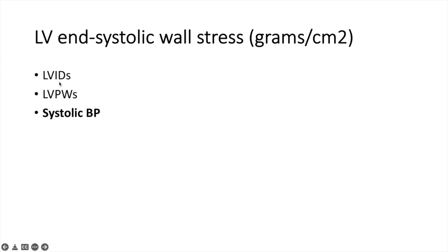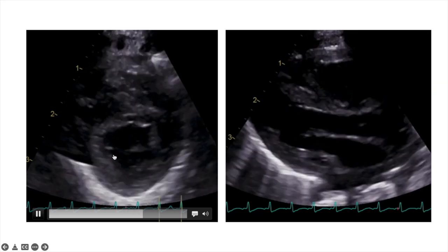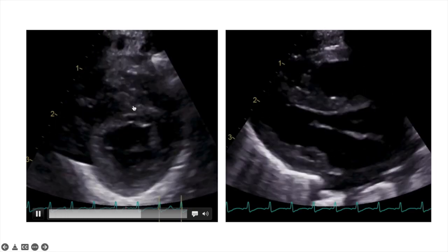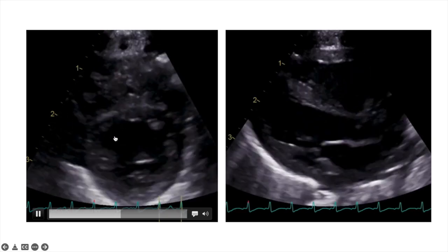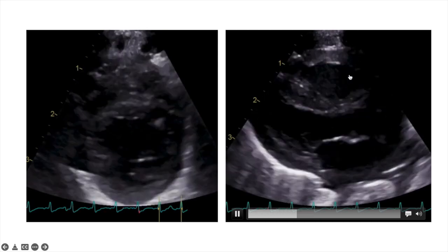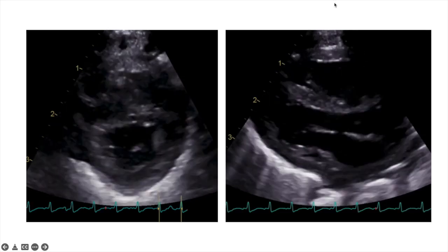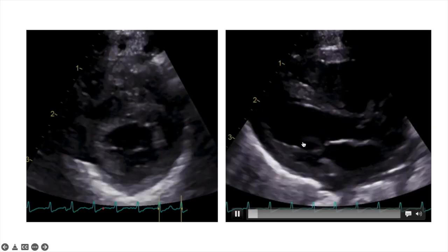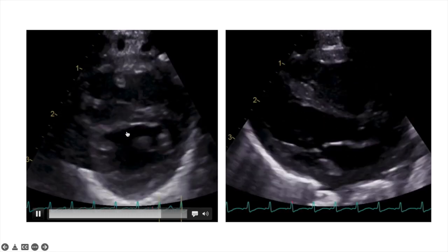You can get those measurements from any of these echo views. On the left is the short axis view at the papillary muscle level, showing the left ventricle with the right ventricle on top, the two bright papillary muscle spots, and the interventricular septum. The view on the right is the parasternal long axis view, showing the right ventricle, interventricular septum, and left ventricle. You run the M-mode cursor through the RV and LV at this level, or similarly through the left ventricle in the short axis view.